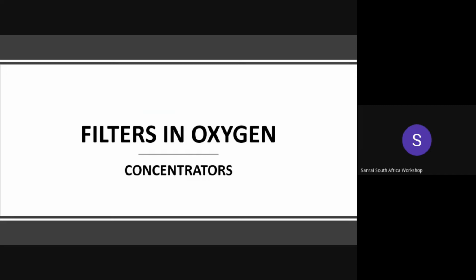This air contains millions of particles, which include dust, dirt, smoke, molds, bacteria, and other pollutants, some of which are micron-sized and cannot be seen by the naked eye, and they can penetrate through very tiny openings. Particles of this size can easily enter and clog the internal components of the concentrator, and they can also penetrate deeply into the lungs of the patient using the machine.